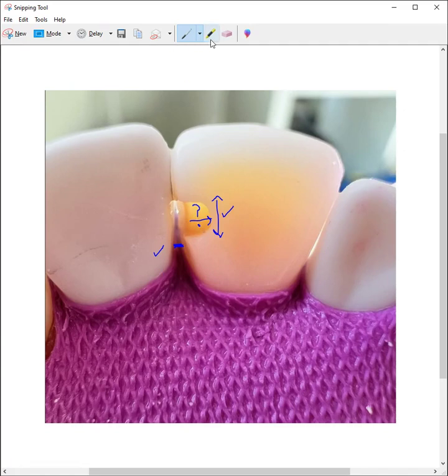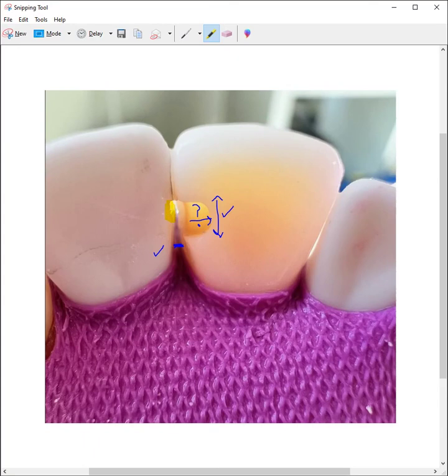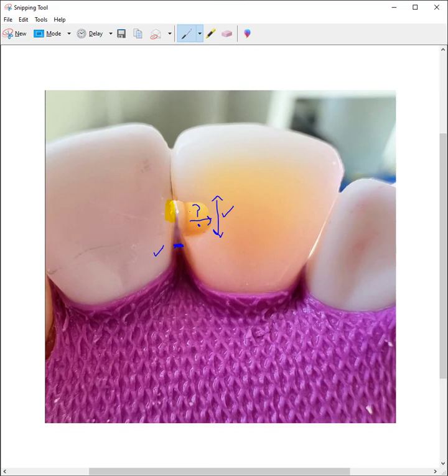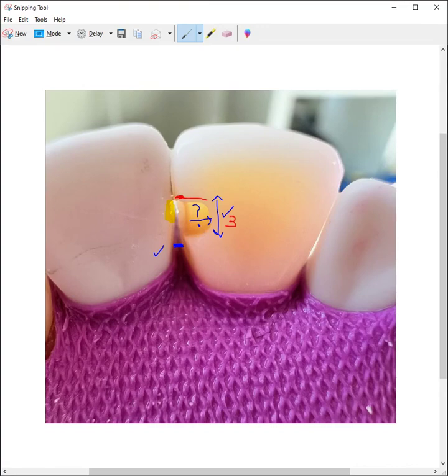The other thing that I would say is that you want to polish this, this little area here, make sure it's clean and smooth. So you can go up a little bit more. So if you see something up here, let's say you can take this up to three. So if you see something, you can extend it a little bit more. But overall, a very good start.